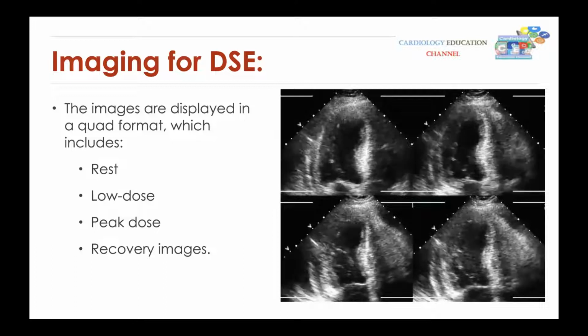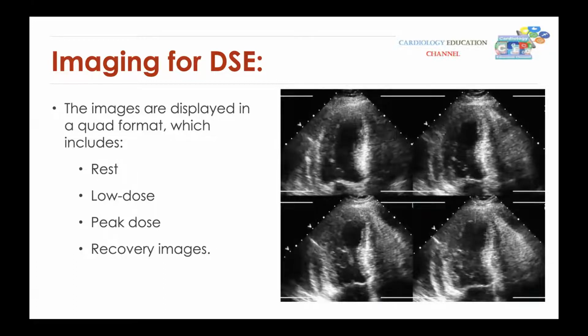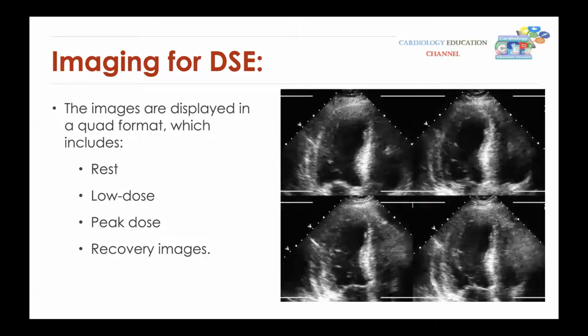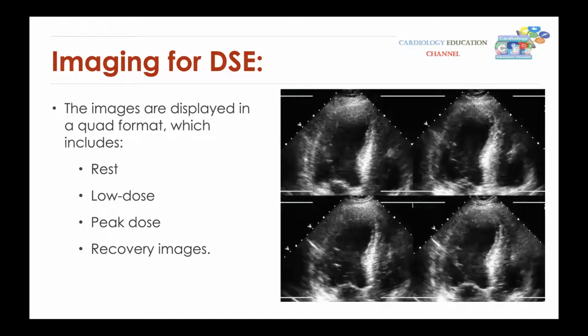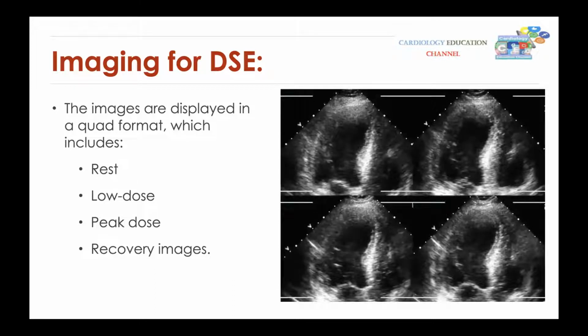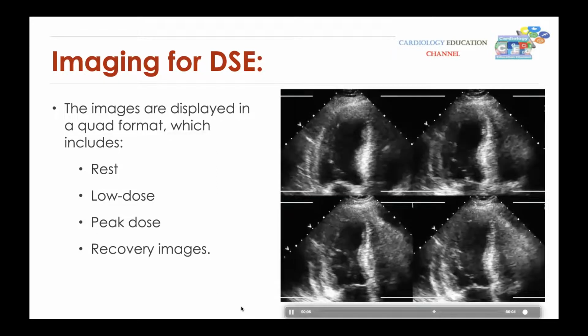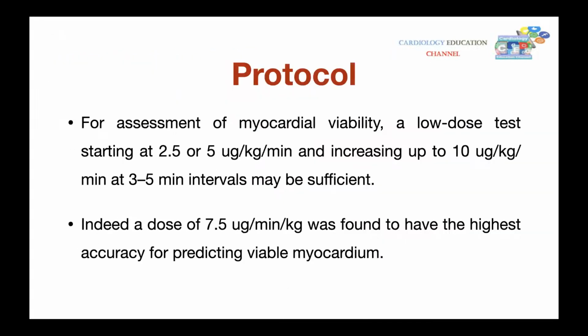Using this software is very important for direct comparison of the changes that occur all through the test, from the baseline to the peak response. So this is very important to use this software. You cannot use just the regular imaging screening that you are using in the regular studies. So how would you infuse the dobutamine to achieve this?